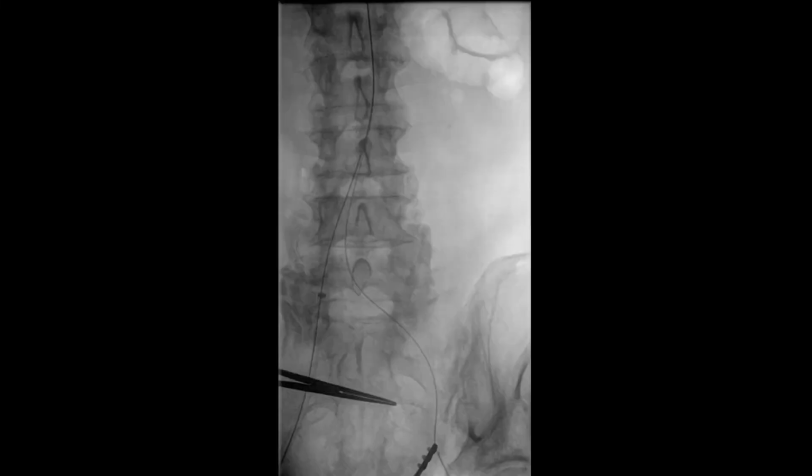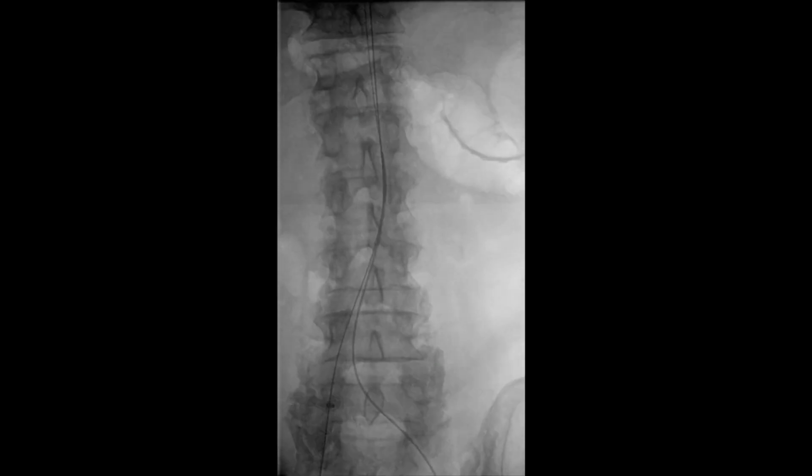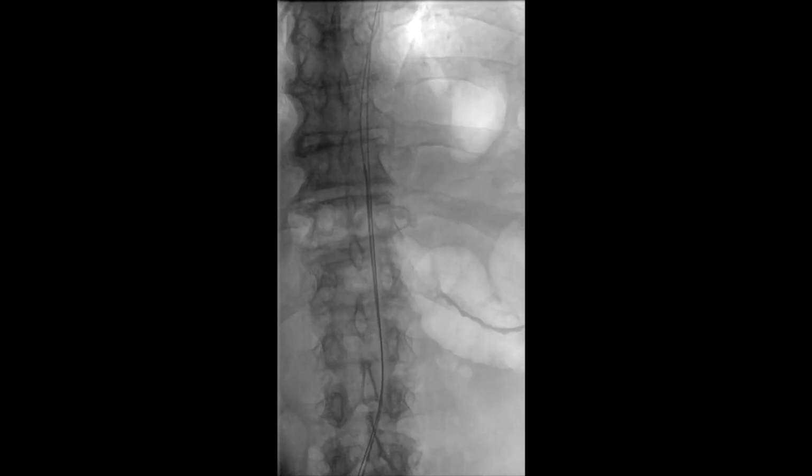A mini stick needle and wire was then used to access the left common femoral artery. We then upsized to a Benson wire and a 6 French sheath. This was followed by exchange for an Amplatz super stiff wire and placement of a 16 French sheath through the left common femoral access site.